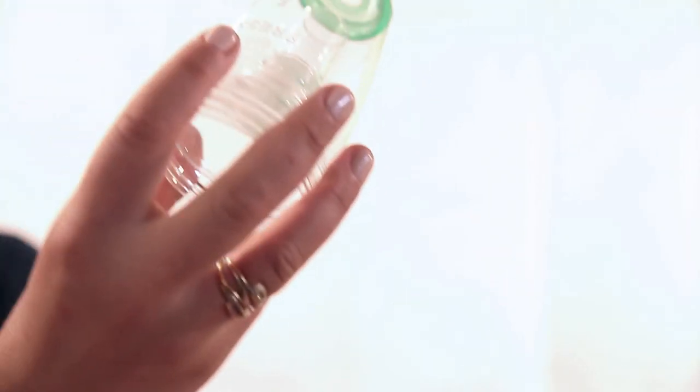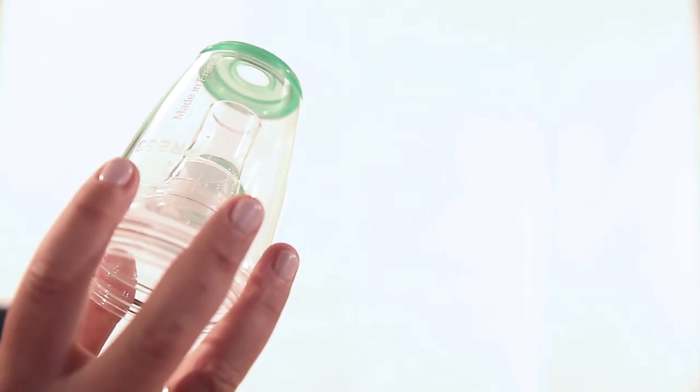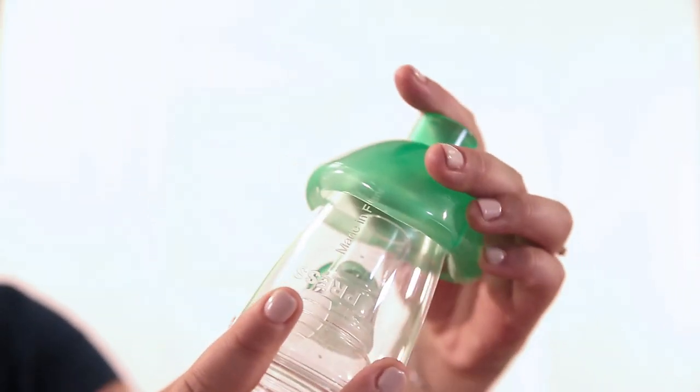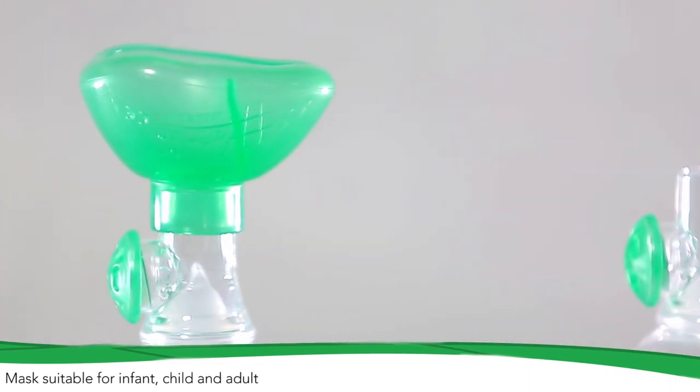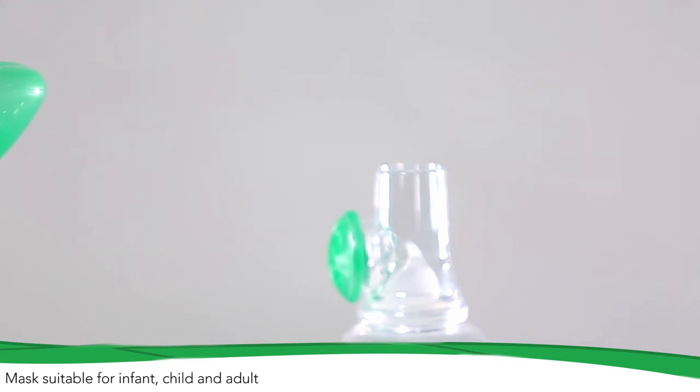Various mask models are available to fit every patient's needs. Your doctor prescribed a chamber adapted to your medical treatment. This valved holding chamber is part of your treatment. Make sure to use TIPS-HALER as recommended by your healthcare professional.